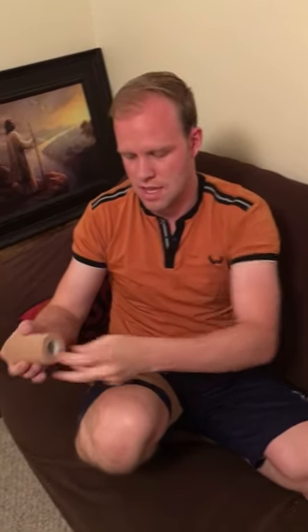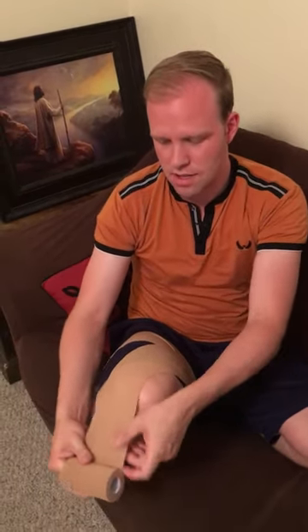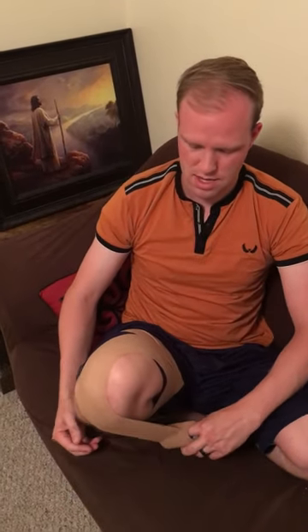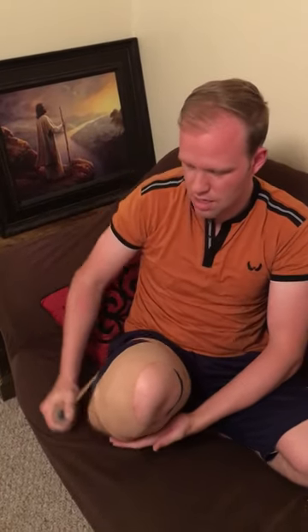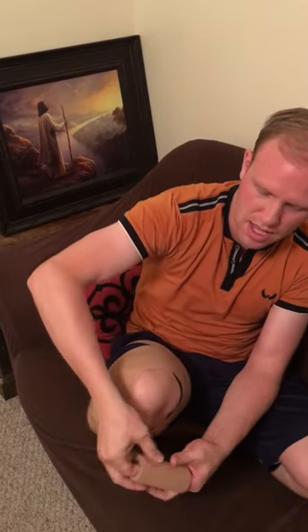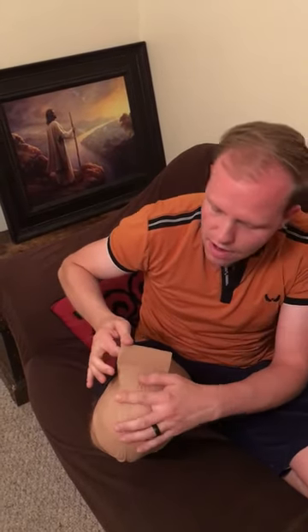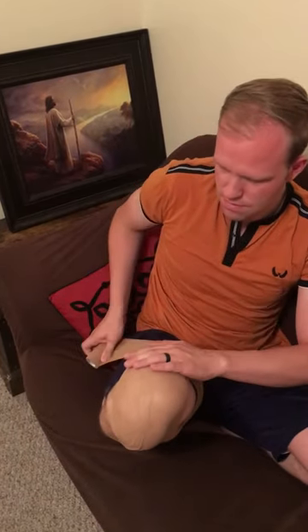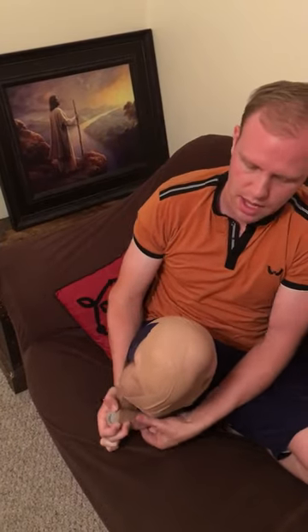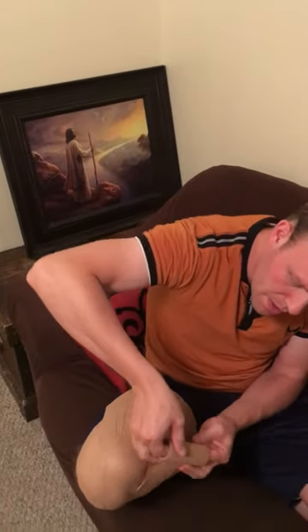We're going to anchor it there and then we want to make sure there's no wrinkles or creases. We come in a diagonal, cover the stump like so. Come over again. Come across like so. And again we're trying to make sure there's no creases. Come up and cover.